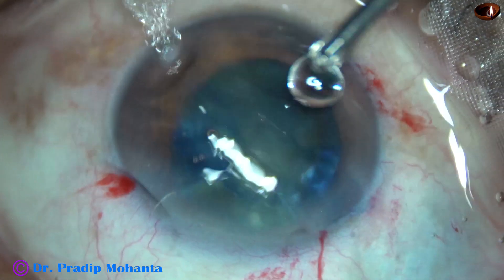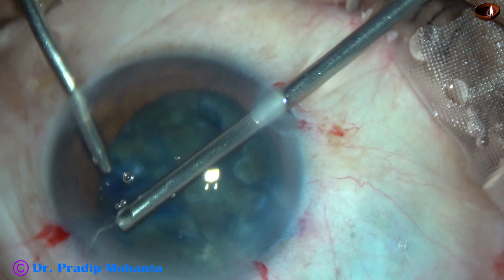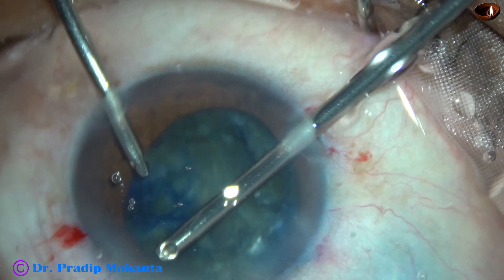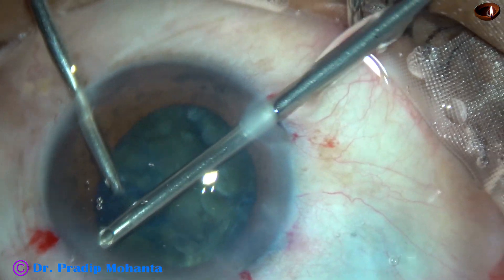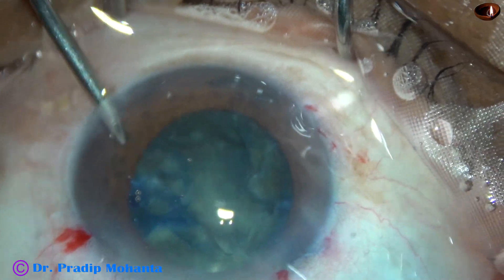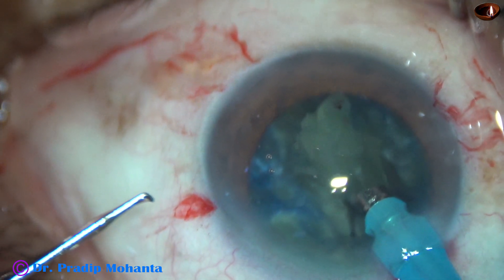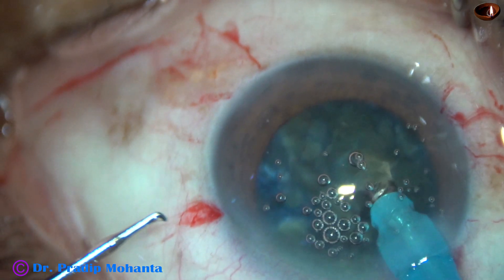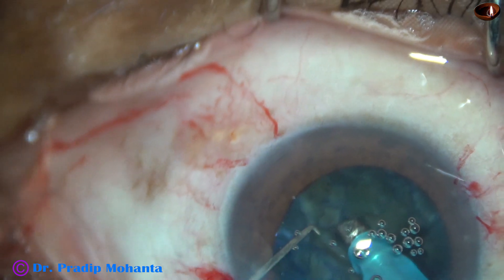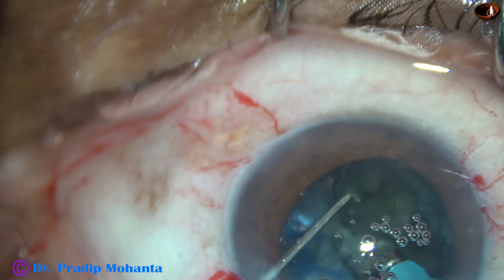And now I am going to trim the vitreous strands going through these two newly made side ports at 8 o'clock and 4 o'clock. Nicely trimmed. And now I manage the nucleus. The vacuum has been reduced to 300 — initially it was 450 — and flow rate has been reduced to 30.